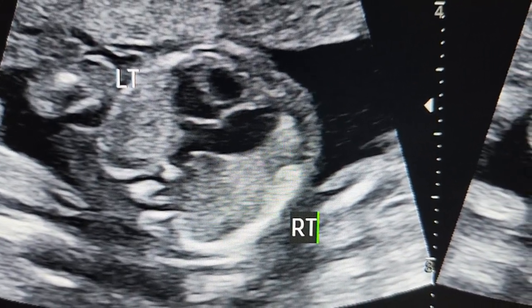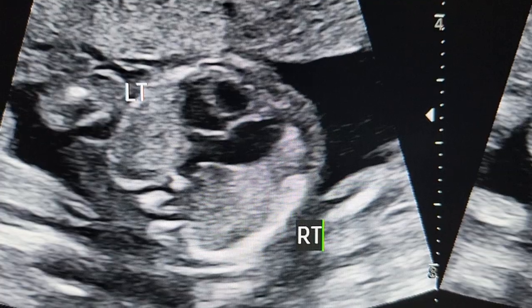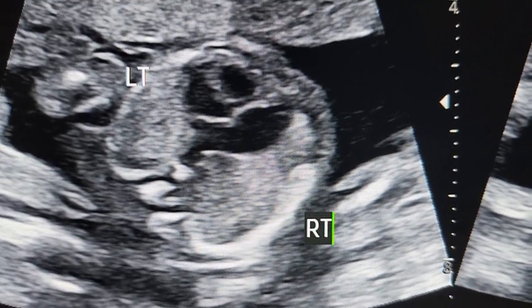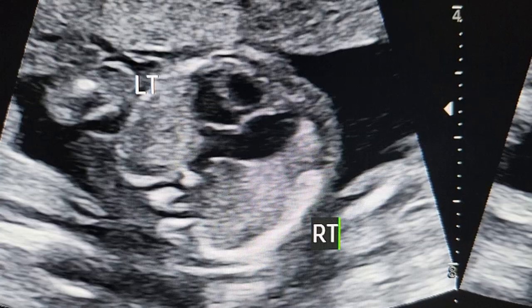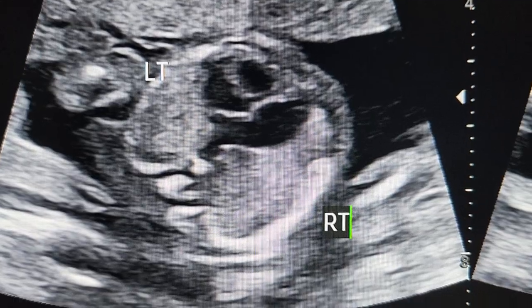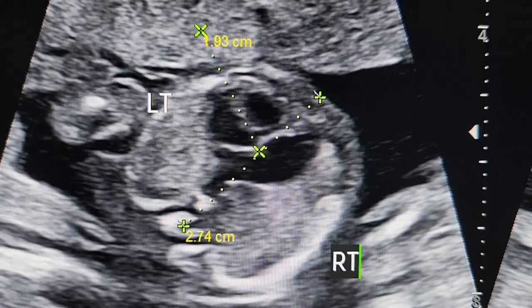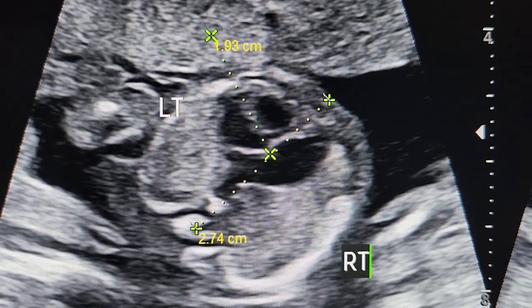In our four-chamber view in a proper axial section, we see that the apex of the heart points to the left side. We have already labeled the left and right of the fetus, so it is a levocardia. You can see that the interventricular septum is aligned a little more than normal towards the left side, so the cardiac finding in the four-chamber view is a slightly increased levocardia.